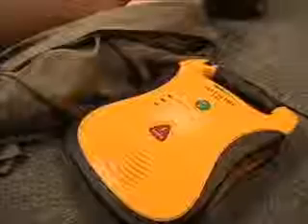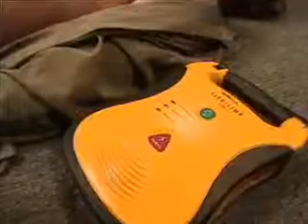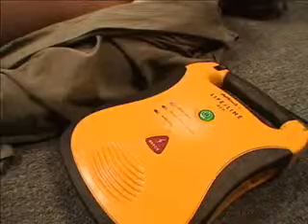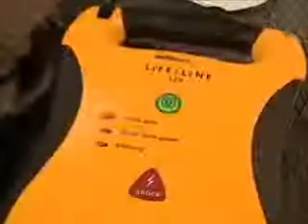Once you've determined that the victim needs treatment, start by turning the Lifeline AED on. To turn the unit on, simply press the on-off button. Call for help. Remove pads from package in back of unit. Apply pads to patient's bare chest as shown.